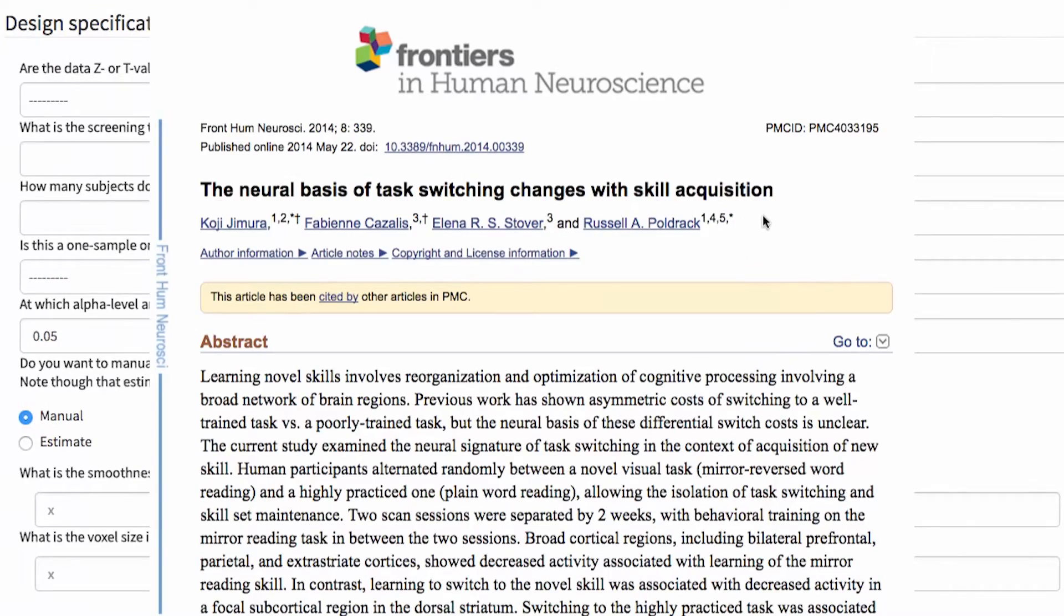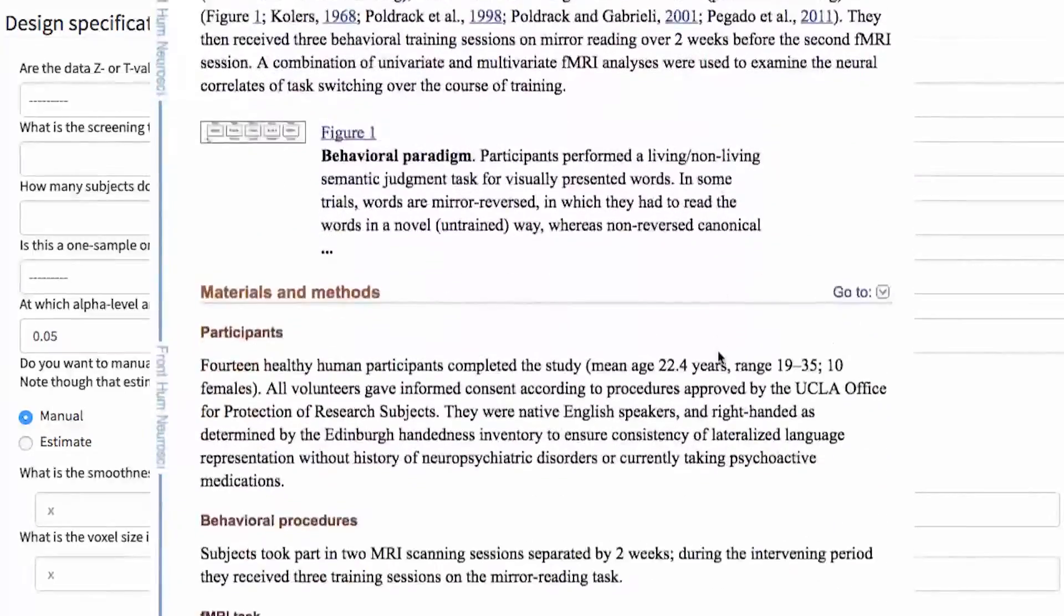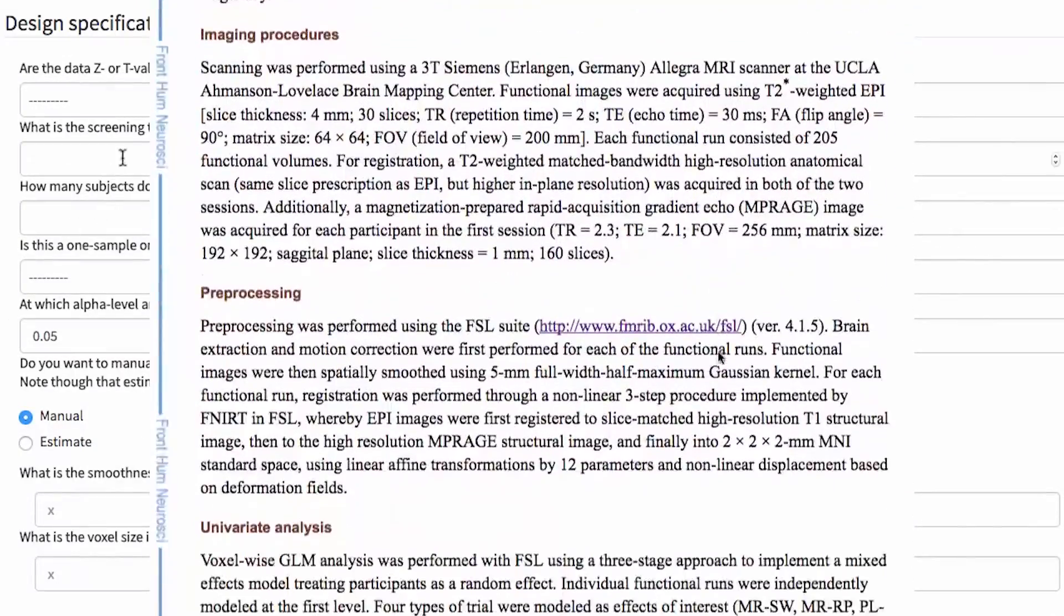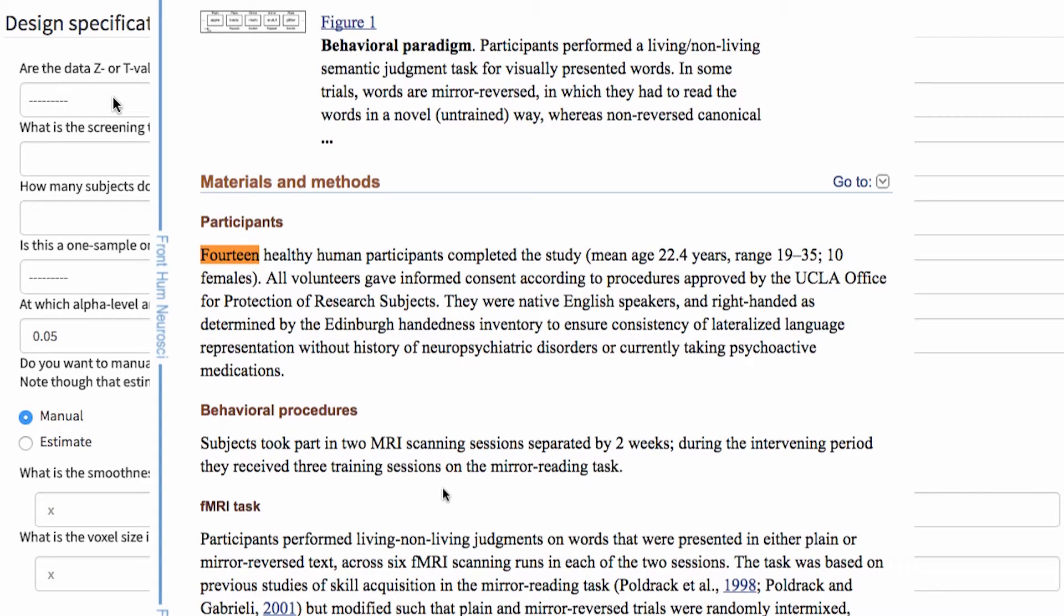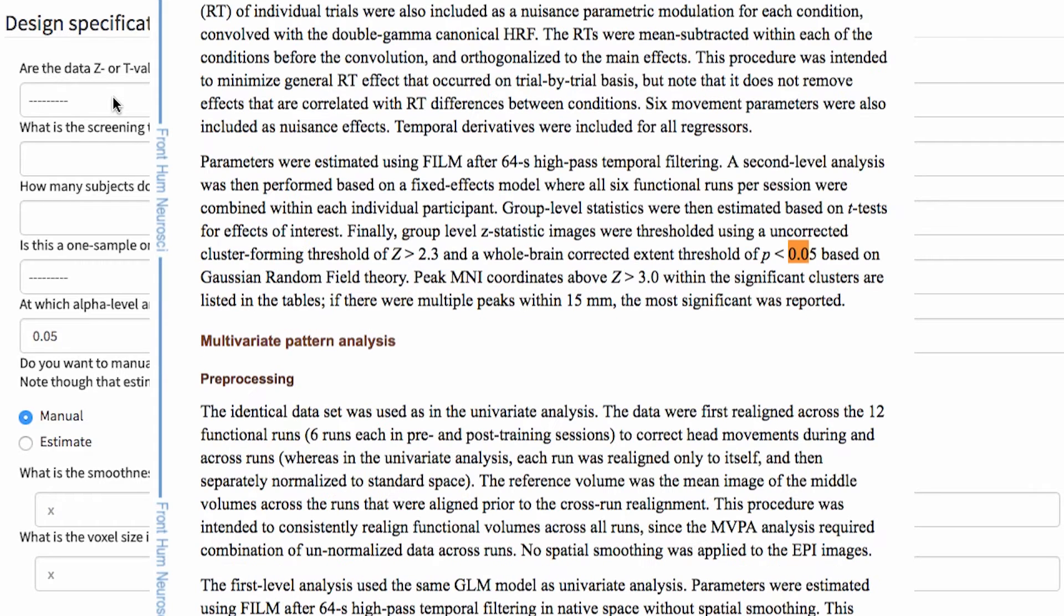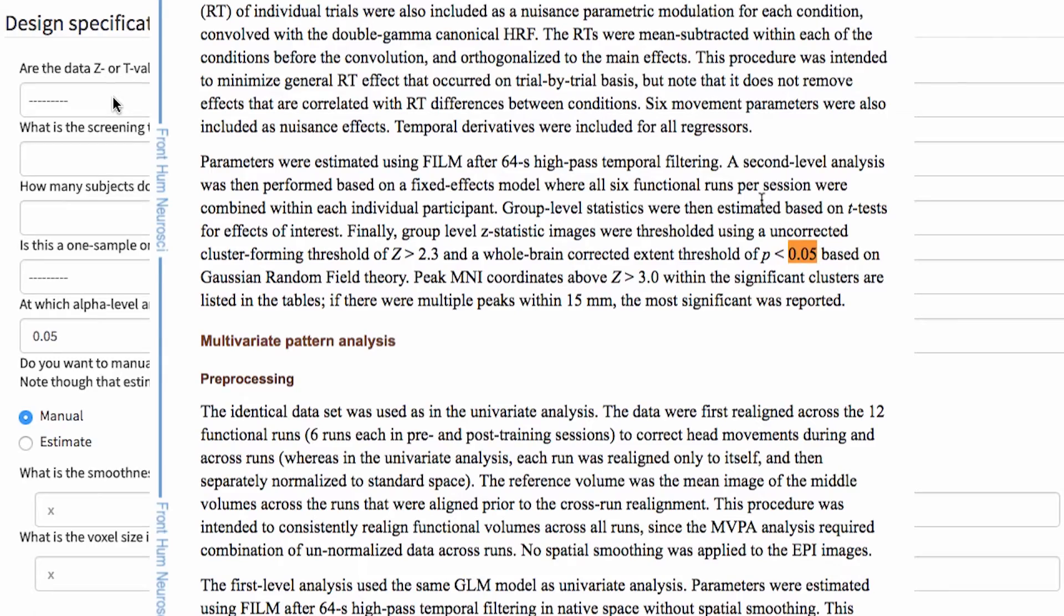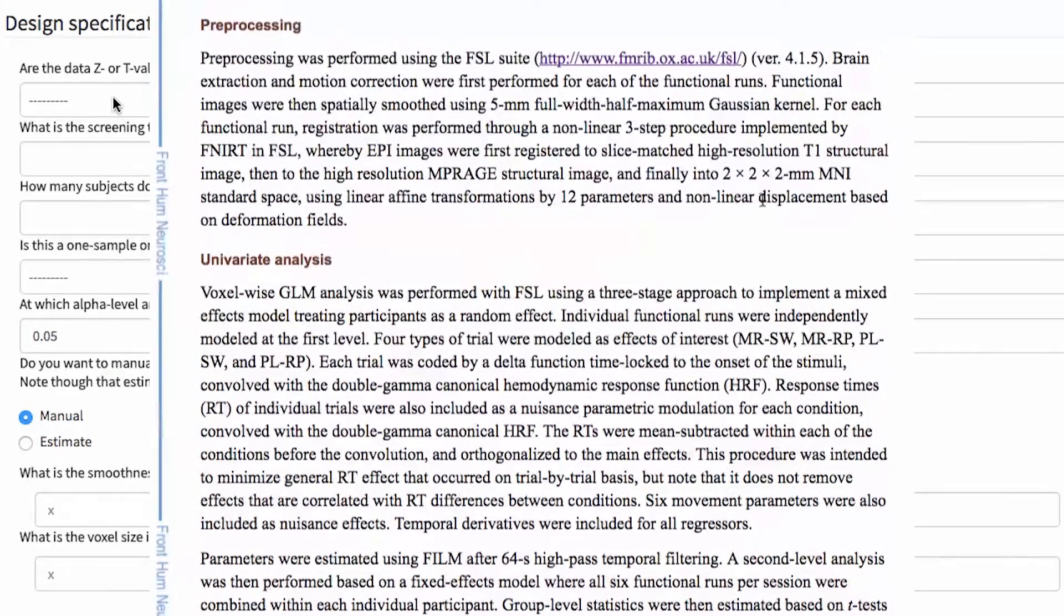You're going to need to read the paper from these pilot studies, if you pull them from NeuroVault, to know different parameters you'll need for the power analysis. For example, are the data Z or T values? What's the screening threshold? How many subjects does a group map represent? Is this a one-sample or two-sample test? What's the alpha level for the statistical test? Usually this one is just 0.05.